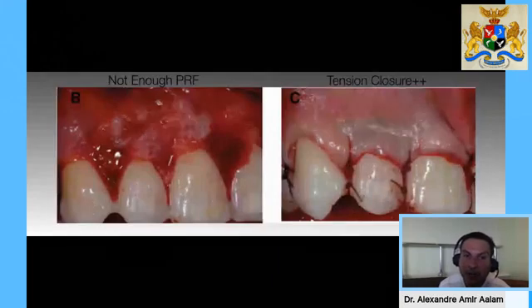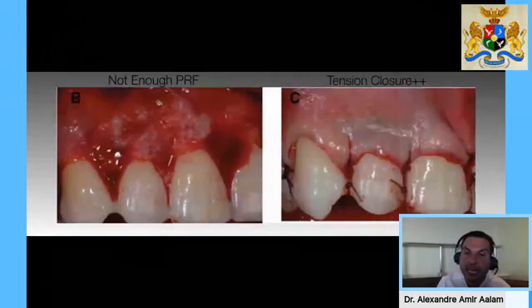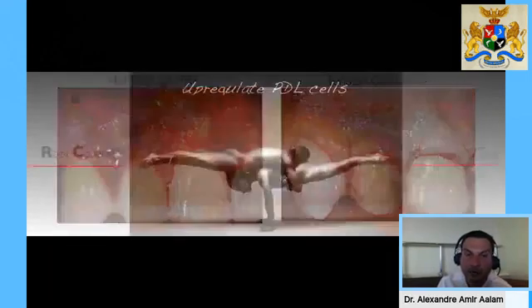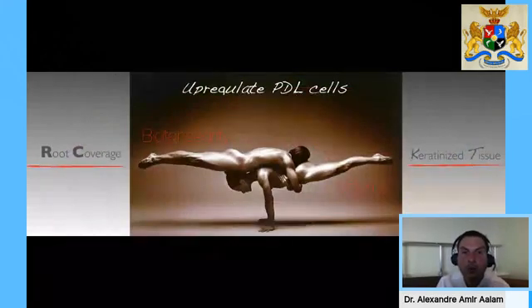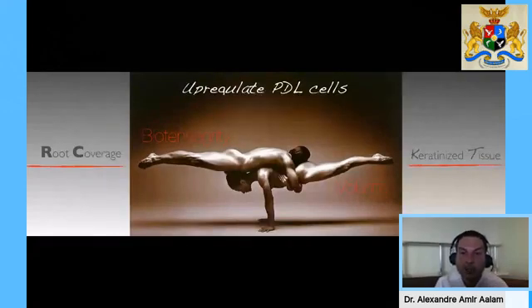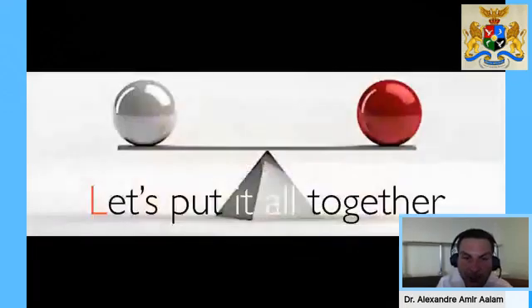Understanding again that PRF is not connective tissue, it doesn't have the same physical properties as connective tissue, and it will resorb if you have too much compression pressure on those membranes, and will not allow this 2 weeks of release of growth factors. So the concept that we had here, this hypothesis, was to upregulate the PDL cells that we have around those roots by increasing the volume, respecting the concept of biointegrity by modifying our surgical technique. And the aim was to get more root coverage and an increase of keratinized tissue.